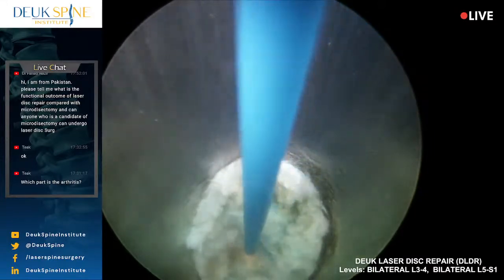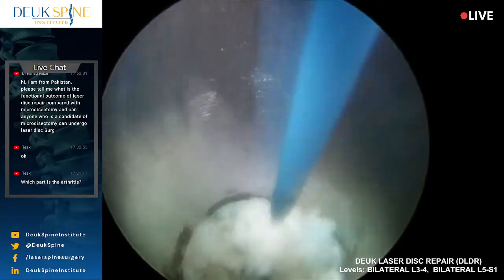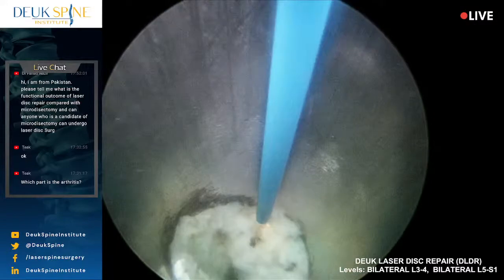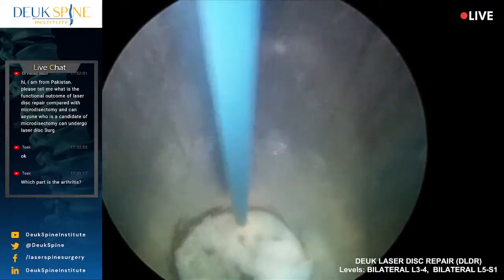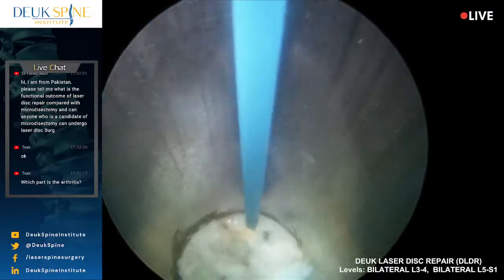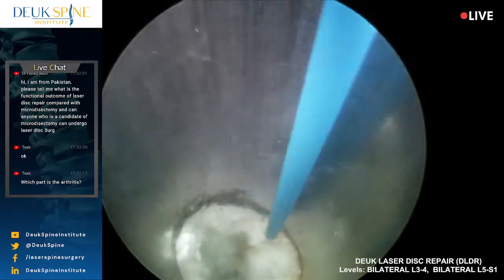No, Diego. He hasn't responded, but I'm sure he has. I've never seen a disc so badly damaged. Honestly, go back and watch all my surgeries. This is the worst. Luis, have you ever seen one so fragmented?